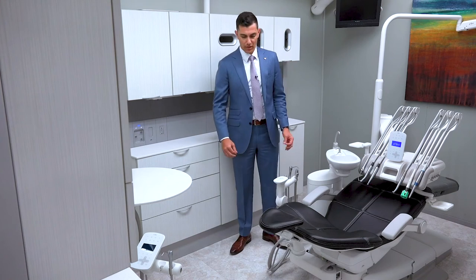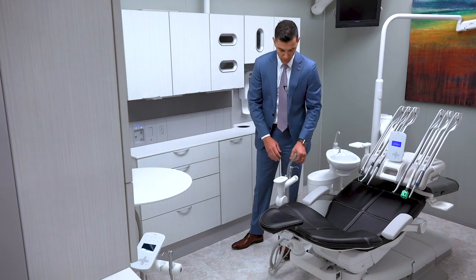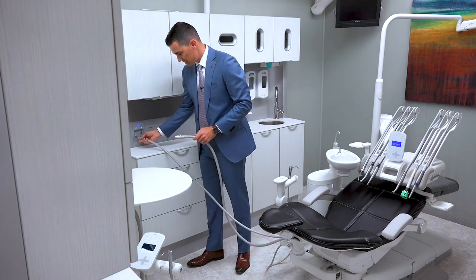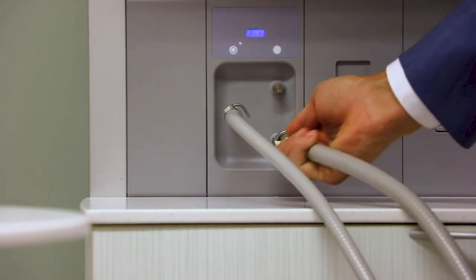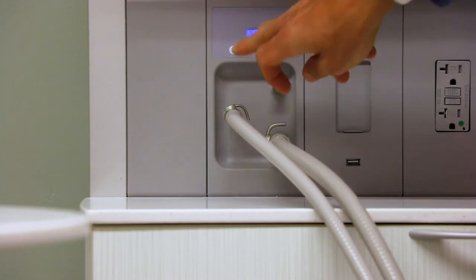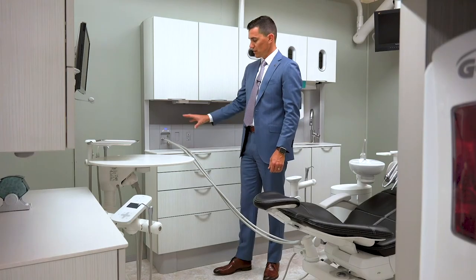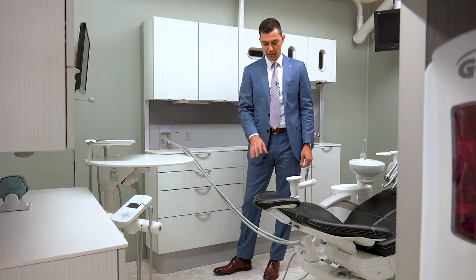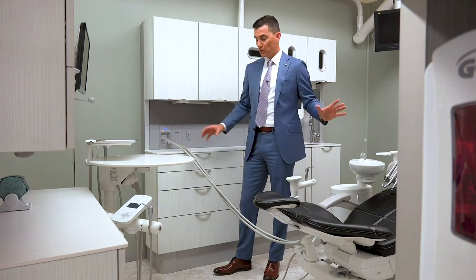Now that we've stored our tank in the side cabinet, we can take our valves and plug them into the ICV itself. When we plug them in, we're going to open the valves — same thing for our high volume. Once they're attached, we're going to turn the ICV on, and that is going to pull the fluid from the tank with the cleaner down through the vacuum to help clean the lines.